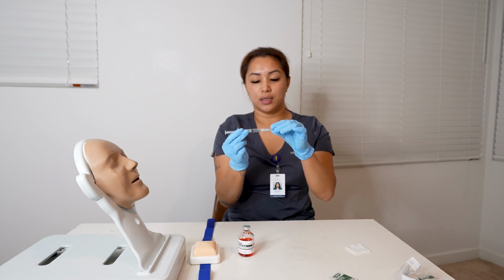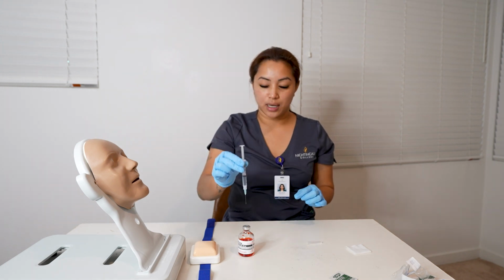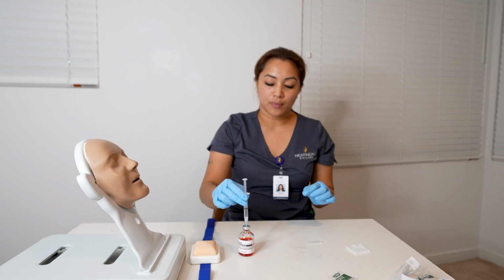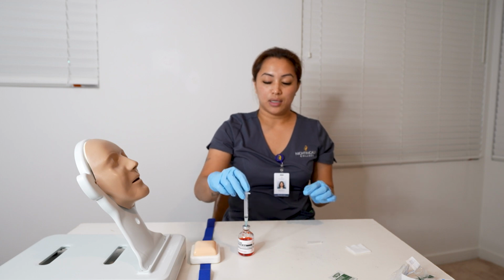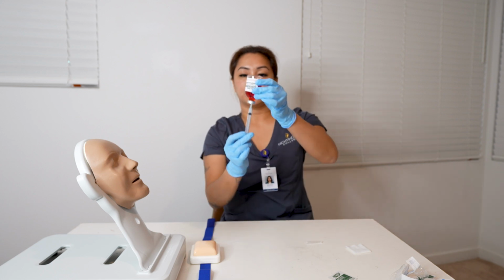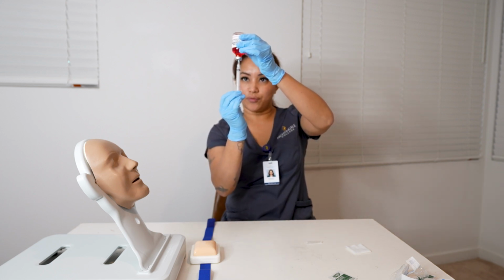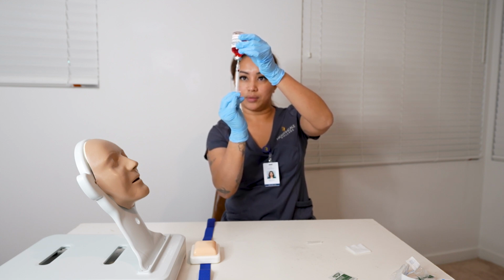Take off the needle cap, place it onto the table. So now straight down into the medication vial. So straight down, 1.5. So now we are going to put the air into the medication vial. Inserted it. So now we are going to invert the medication vial. So now we are going to draw the morphine sulfate. 1.5. Perfect.